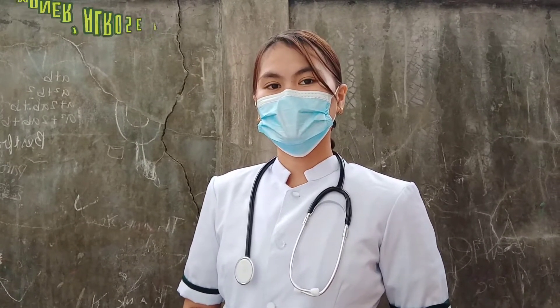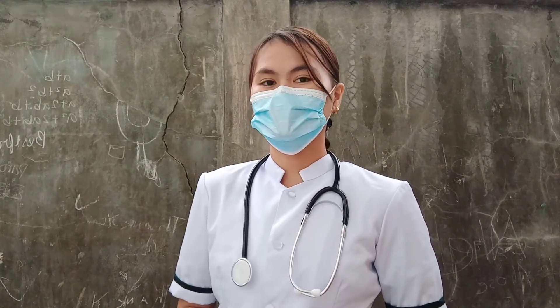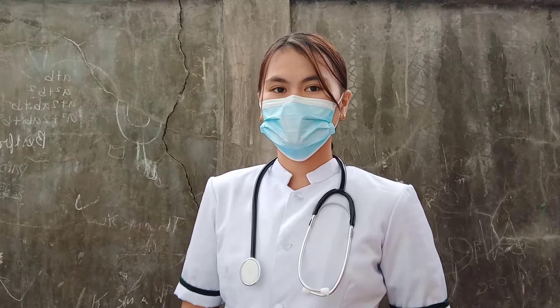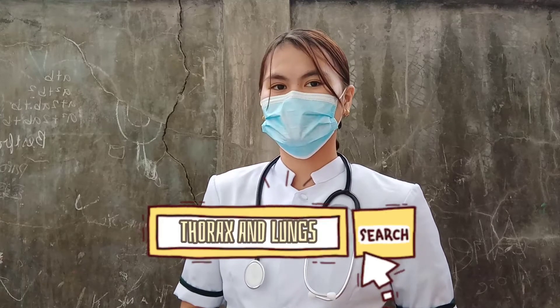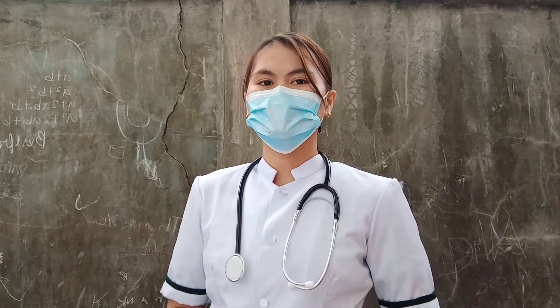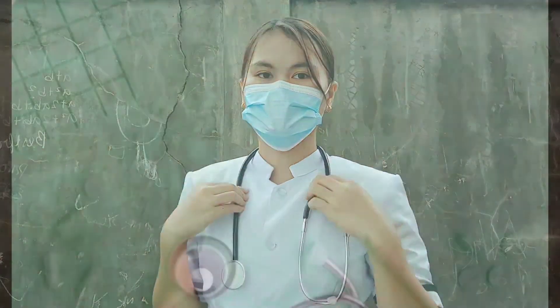Hi everyone, I am Alros P. Mooner, your nurse for this morning, and today we will perform a return demonstration of thorax and lungs. For the equipment, we need a stethoscope.